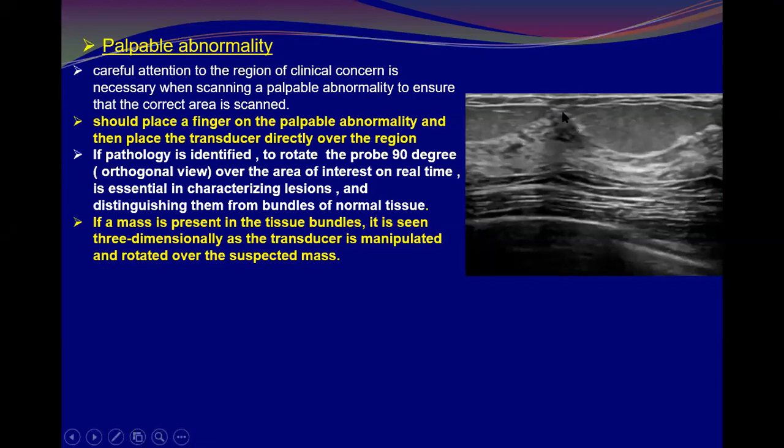Obviously this is a fibrous ridge. The parenchyma is tented, attached to the superficial fascia with minimal pulling, minimal tethering. Excellent. But we have to rotate the transducer and make sure this area of the parenchyma is purely clear parenchyma, nothing else.